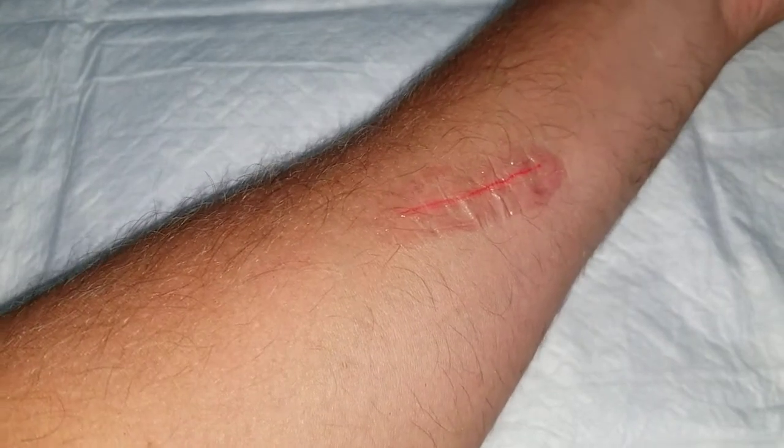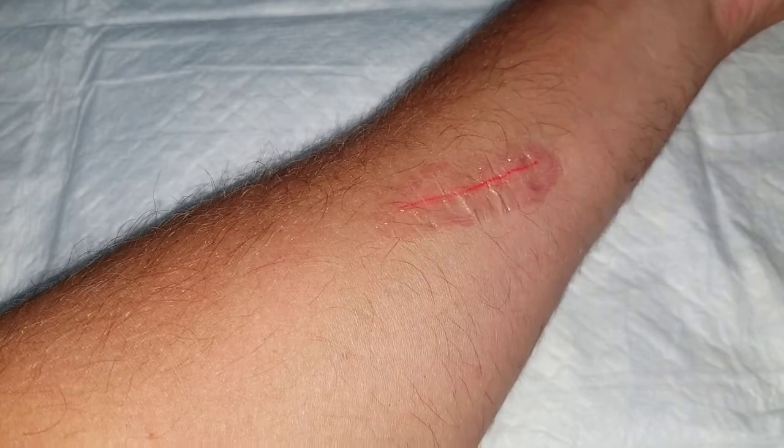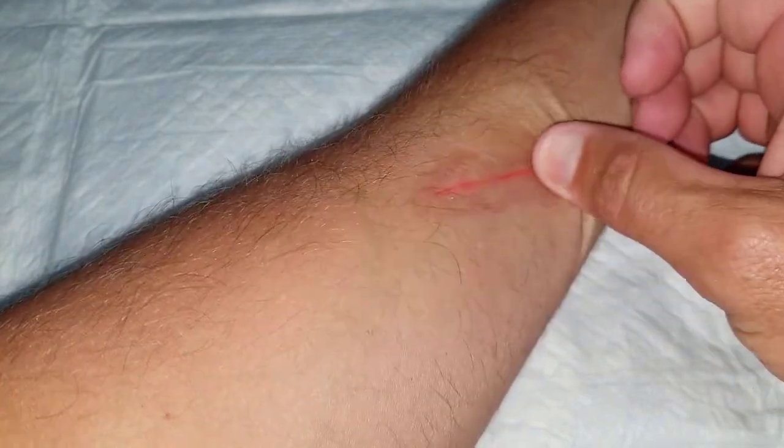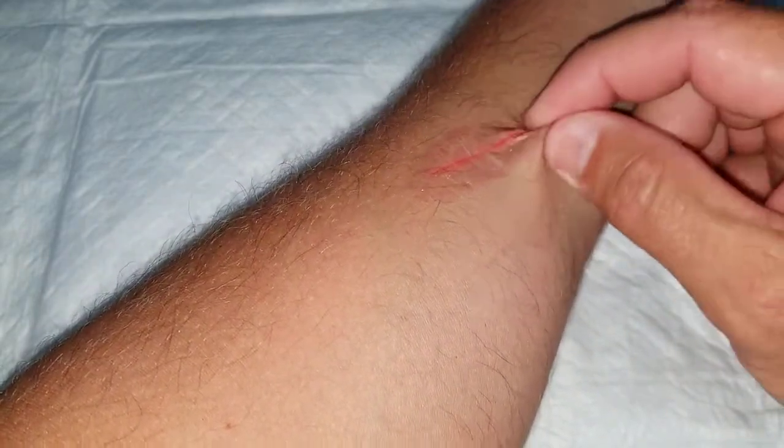Hello, today I'm going to give a little tutorial on how I remove Exofin Tissue Adhesive. As you can see, the Exofin Tissue Adhesive has been applied to the skin, and say if there was a reason you needed to remove it, the nice even coat that you've applied really doesn't give you an edge to grab to be able to take it off, and you don't want to use any acetones or petroleum type products that could get any bacteria from the surrounding skin inside that wound once you remove it.